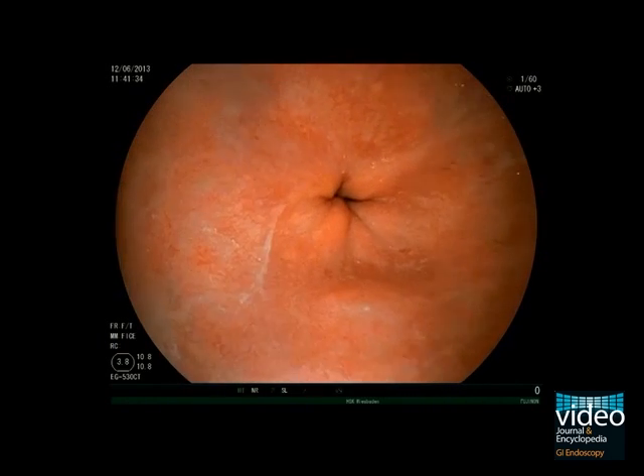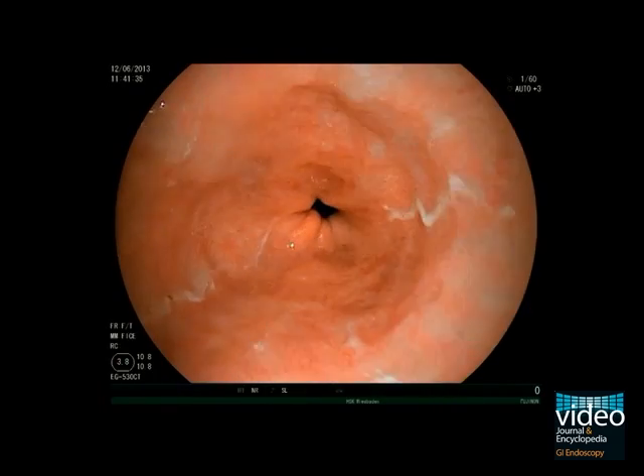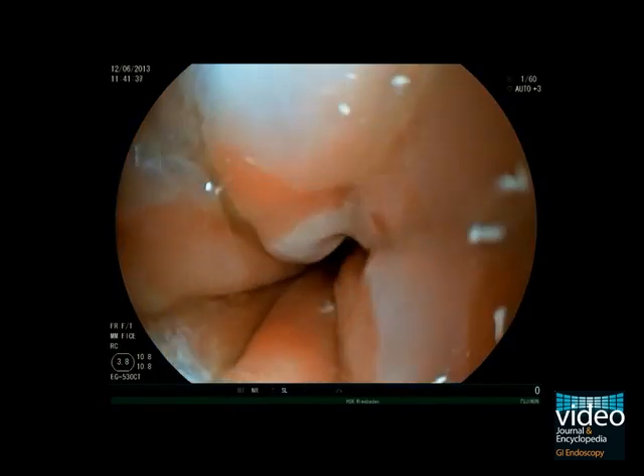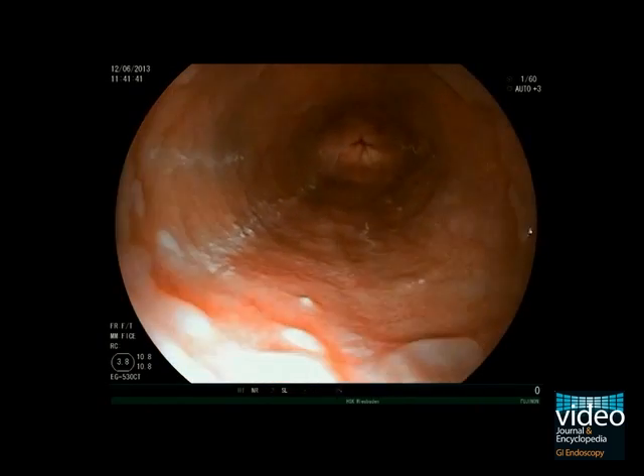Start the measurement at the top of the gastric mucosal folds. The gastric folds have to be evaluated in a deflated situation. Retract the endoscope to the most proximal point where the whole esophageal wall is circumferentially covered by Barrett's metaplasia, and classify this as the C-value of Barrett's esophagus in centimeters.